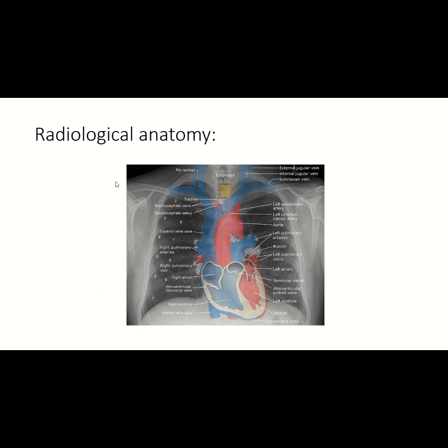As shown in the picture, there is rib cartilage in light gray color, and a darkish gray shows the lung. These are the CP angles, and this one is the clavicle, and this one is the scapula. We can see the thoracic vertebrae. This is the apex of the lung, and this one is the cardiac part.